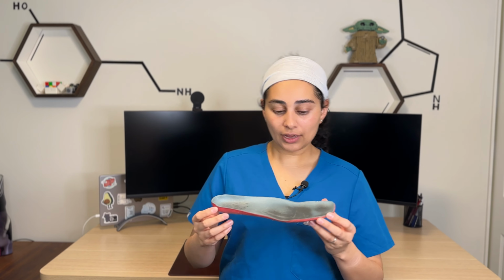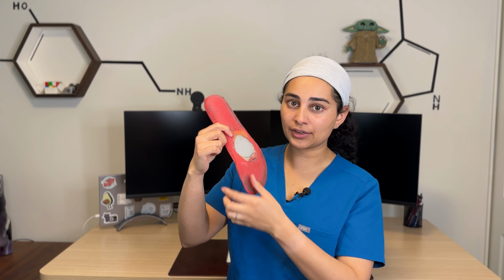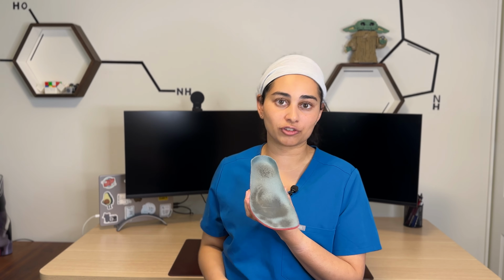So I recommend people wear these in and around the home, and sometimes you can actually get shoes that you can fit these toe spacers into. It's very effective at reversing bunions, at helping to treat them in many cases, and it's a non-invasive approach to it. And last of all, we have something called the metatarsal pad. I'm going to show you what it looks like in an insole. The metatarsal pad is a small little pad that is put just behind the ball of the foot. Why this is helpful is in people who are experiencing metatarsalgia, which means that they're having pain in the ball of their foot. This provides added support so that the ball of the foot does not have as much pressure being placed on it.